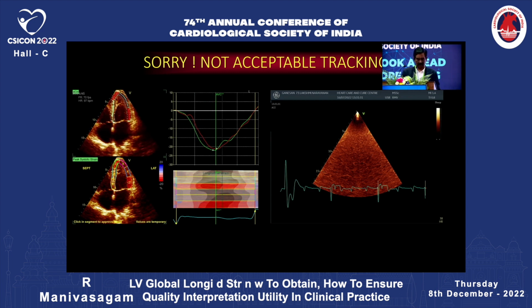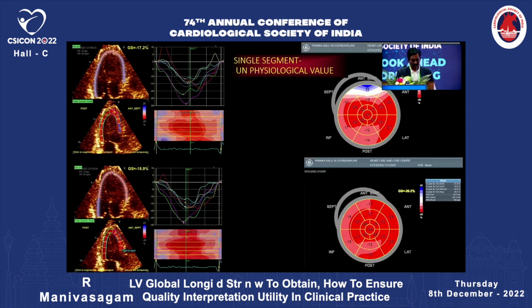I just wanted the basics. Thank you, sir. So the machine will tell you that it is unable to track. You have to get a fresh image and you should not meddle with these images at all.